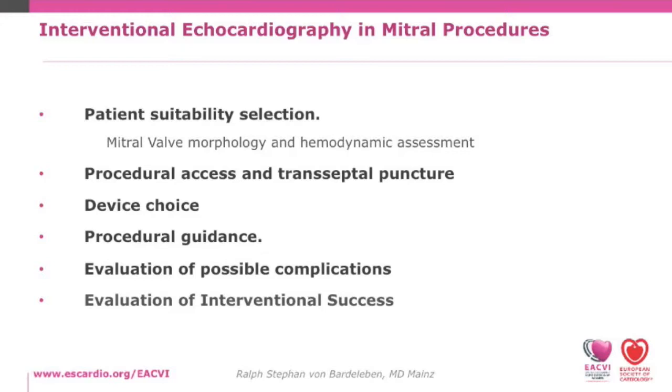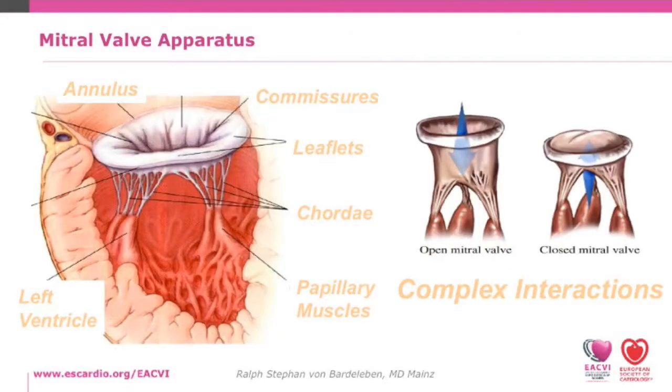and also in the special section given by Dr. Hani Mahmoud later in this talk. We have to select the correct devices, have procedural guidance, the evaluation of possible complications, and of course, the evaluation of the interventional success. As you all may know, the mitral valve apparatus is quite complicated.